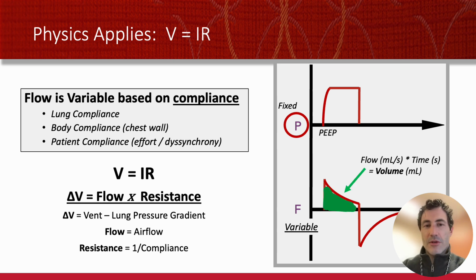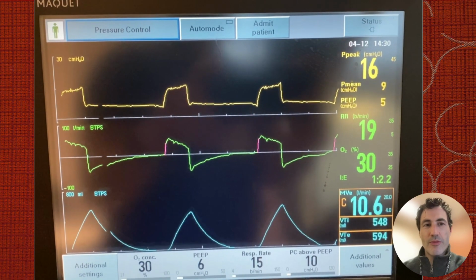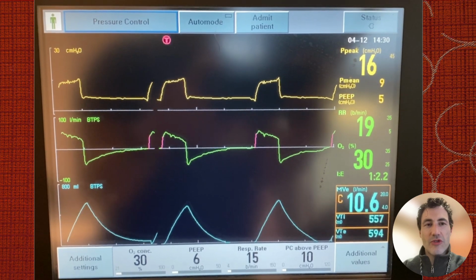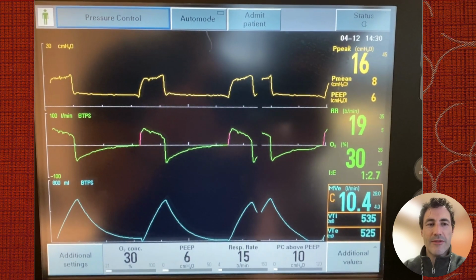Just a reminder, I'm going to rush through these concepts to focus on other things, but the thumbprint under this waveform is about equal to the tidal volume, exactly equal to, in fact. So if you want a bigger breath, that thumbprint should be bigger. Here's an example of a pressure breath. We see pressure turns on, you get decelerating flow, and you breathe out passively.